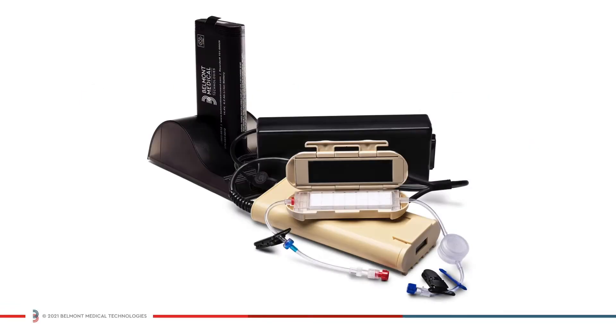The Belmont BuddyLite system consists of the heater unit with battery compartment, a battery pack, and battery charger. The Belmont BuddyLite AC additionally includes an AC power pack for continuous use.